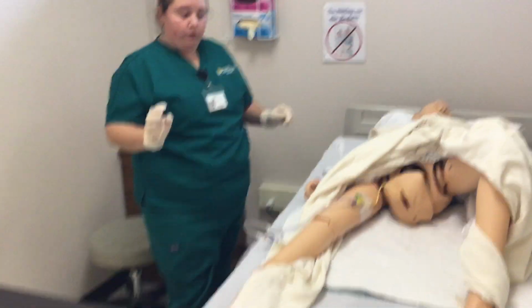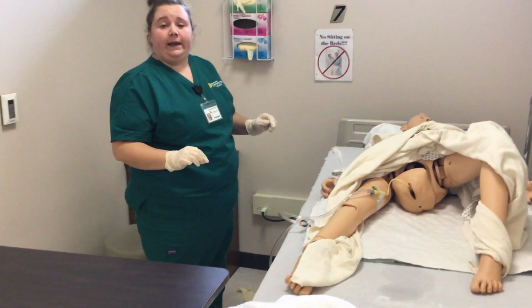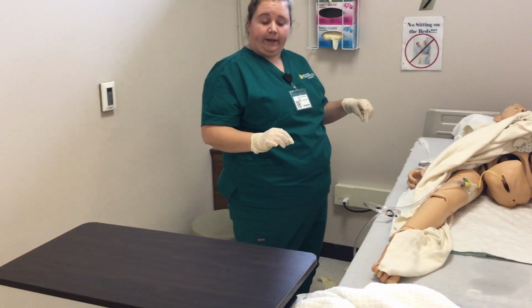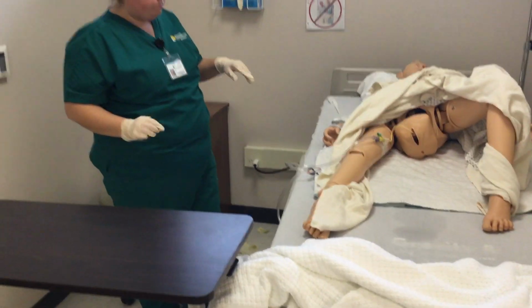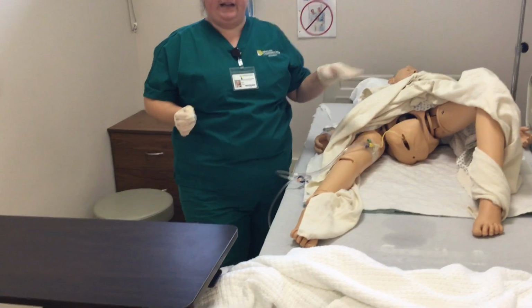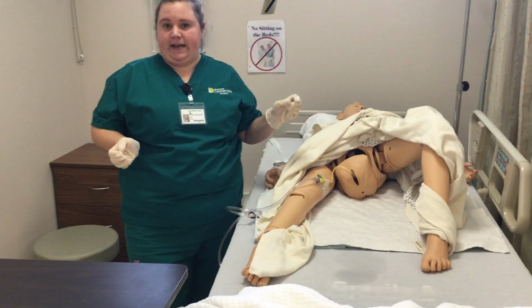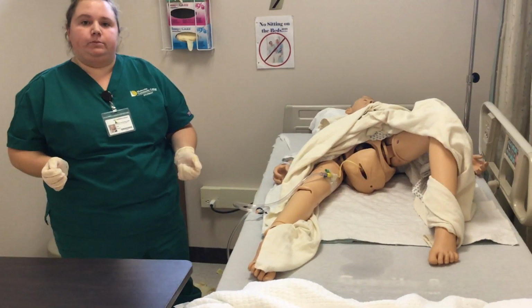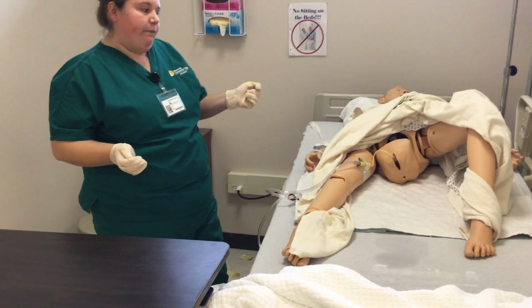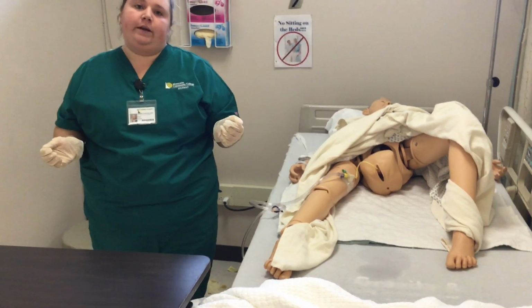I want to note that I would not hang the bag on the railing or let it hang on the floor. I would provide any hygiene to the area right now if needed, and make sure everything is flowing through the tubes just fine. And I would measure initial urine and record.